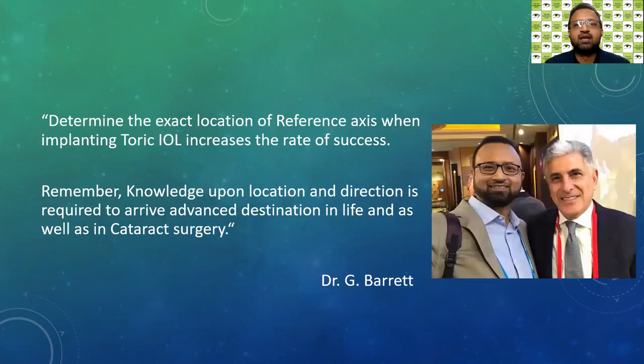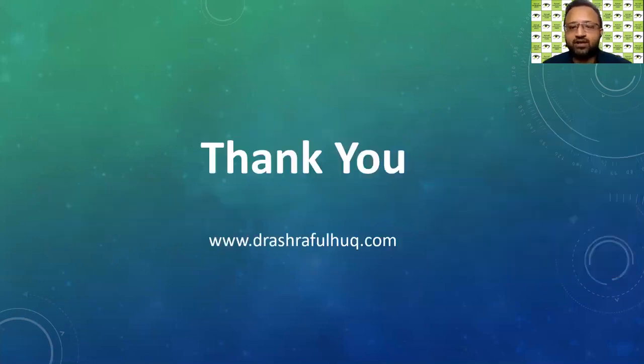I want to end my talk by saying, a great talk by Dr. Graham Barrett, who has made lots of contributions in toric IOL calculation: determining the exact location of the reference axis when implanting a toric IOL increases the rate of success. And remember, knowledge of location and direction is required to arrive at one's destination in life as well as in cataract surgery. Thank you very much.